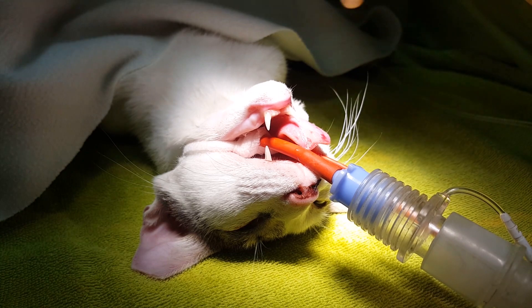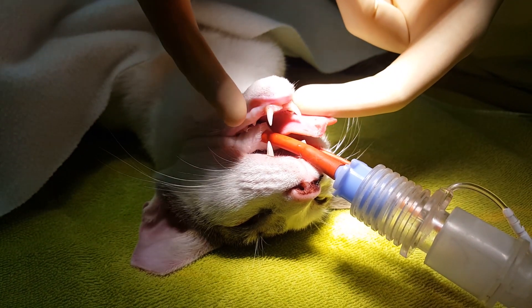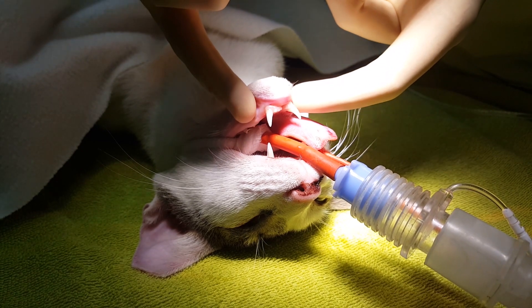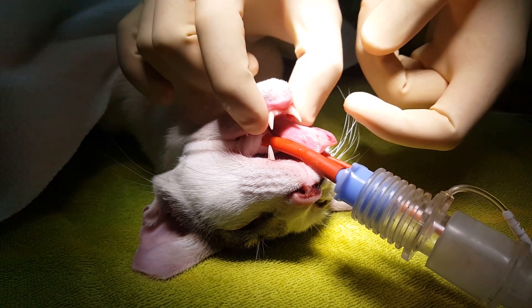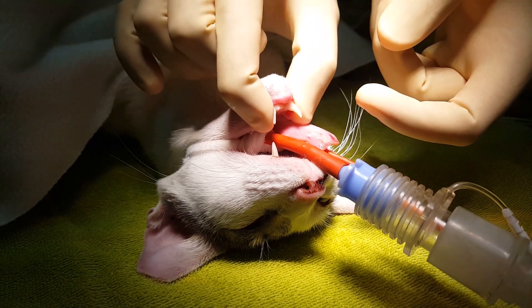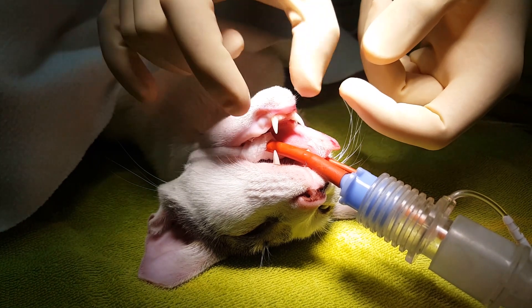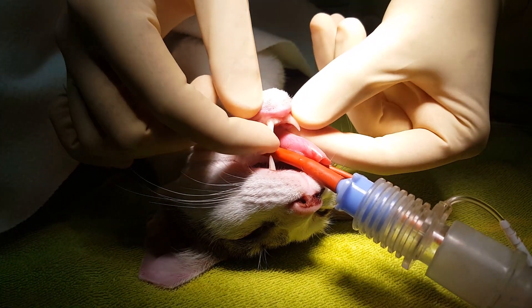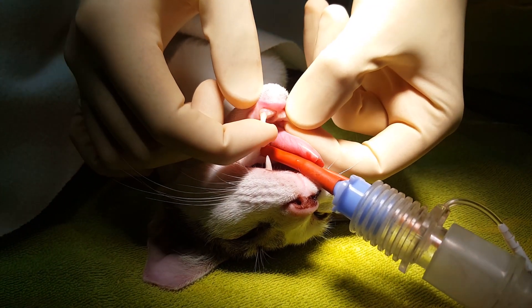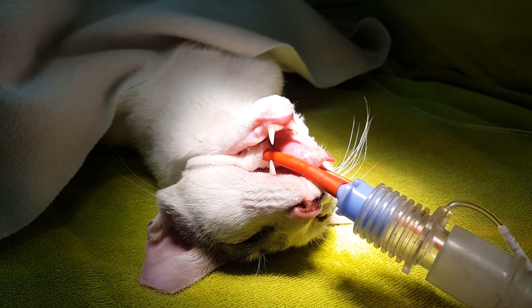What we're going to do today is place a metal wire around the left and the right branch of the mandible to keep the fragments together and give more stability to the jaw. The cat is not going to be able to eat for the next few days — we're going to place a feeding tube afterwards — but in the meantime we're going to avoid the constant dislocation of the left and the right branch of the mandible.